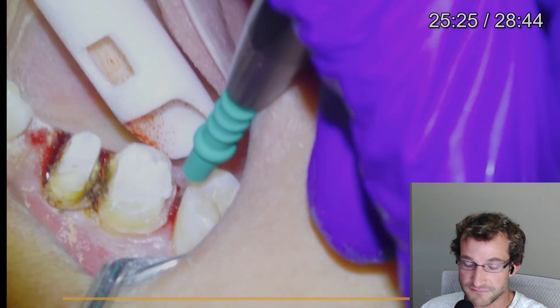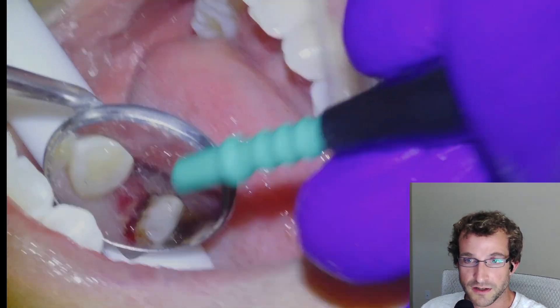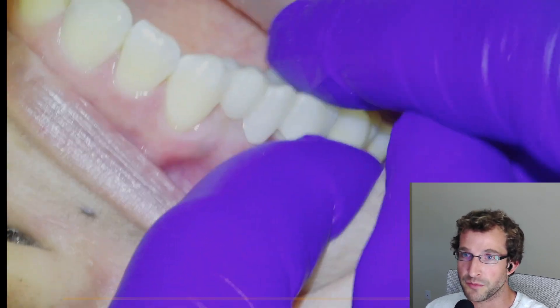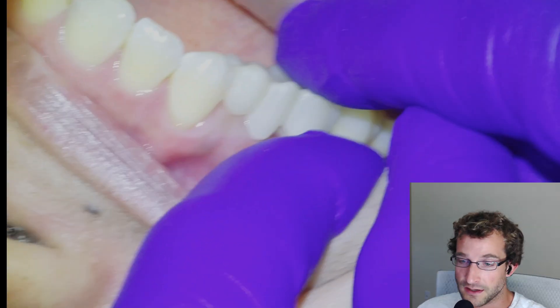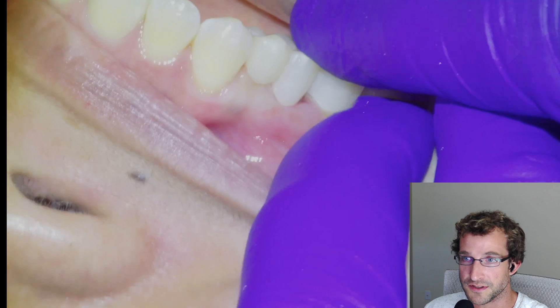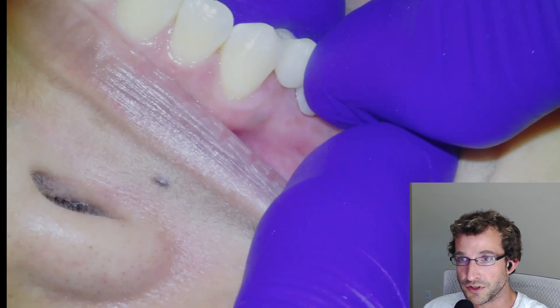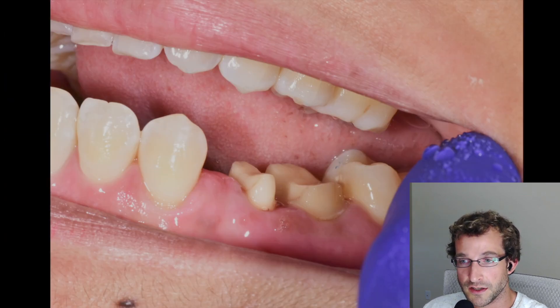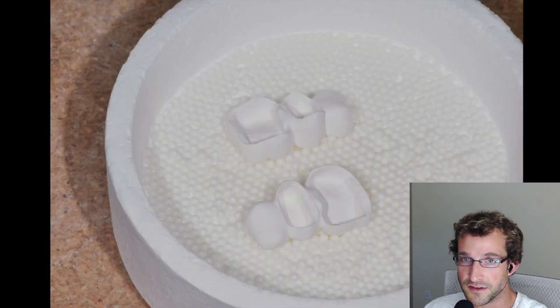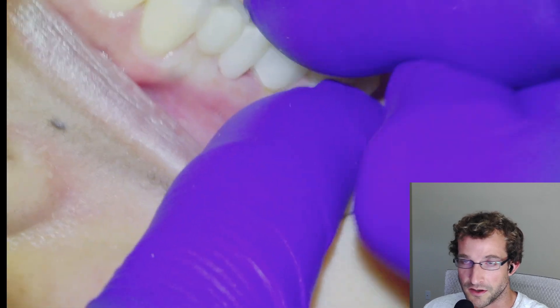And then this is the delivery — I'll put it back on normal speed. This is the try-in appointment. We scanned and then designed the bridge, milled it in-house with the Roland DWX-52D, and sintered and polished it — made two shades. This would have been our shade of choice. This is just the try-in here. We'll put it in and check the fit and the bite. There's the pre-insert, there are the units in the green state, ready to go into the furnace, and here they are sintered and polished.